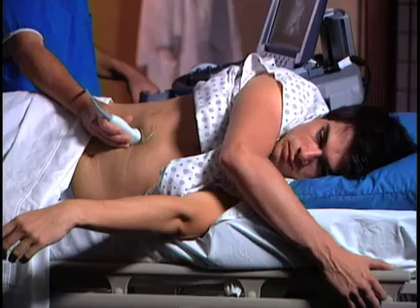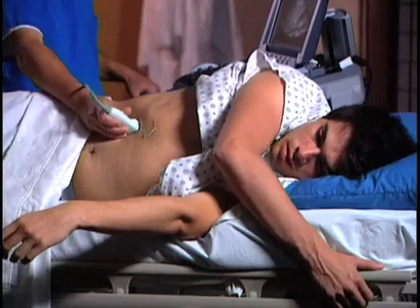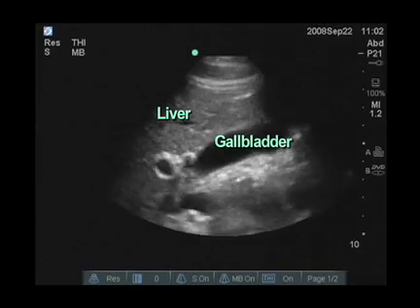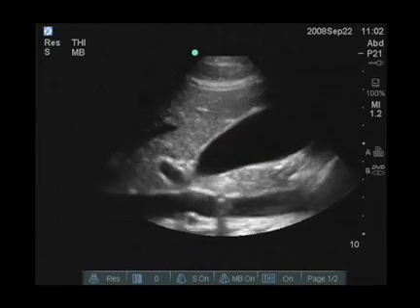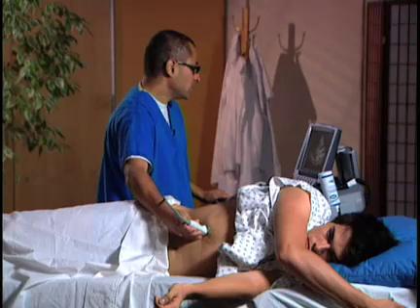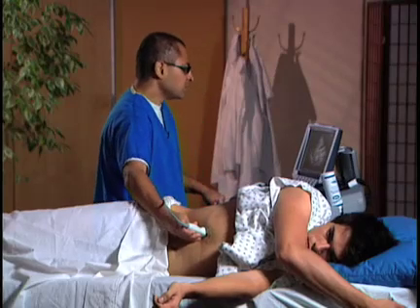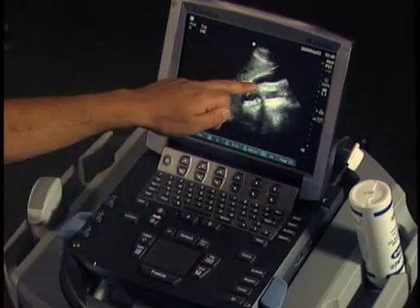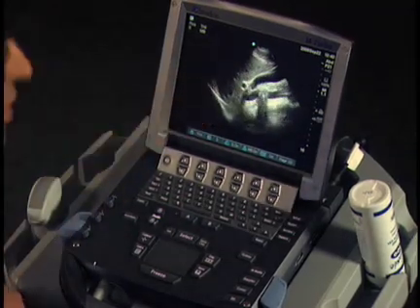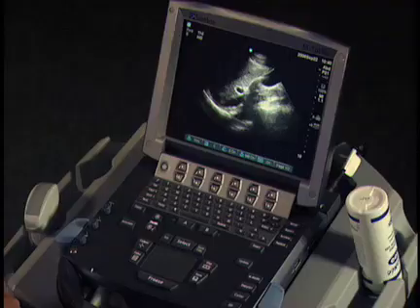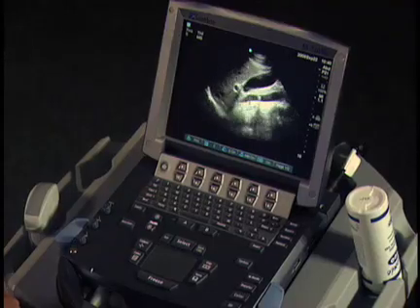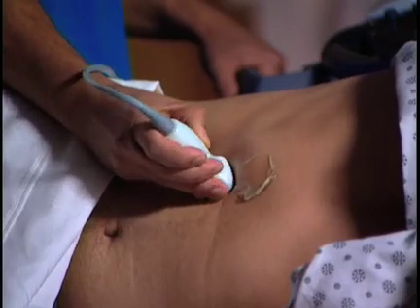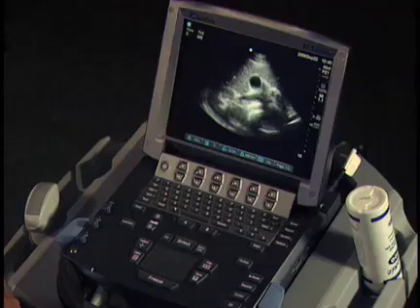When you're scanning the right upper quadrant, sometimes you'll have to have the patient take a deep breath. What'll happen is the liver will be pushed down and the gallbladder will come easier into view — that's a little trick you can use to see organs in the upper quadrant. What we see here on the screen is what we term the exclamation sign. The exclamation sign is the long part of the gallbladder, and a dot — that dot is the portal vein. Together, that is a very important landmark. I'll be scanning through the entire gallbladder in a long axis fashion, then turn the transducer slightly to start scanning in a short axis plane.